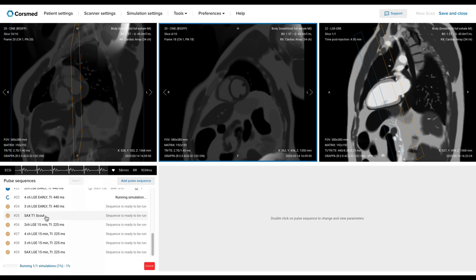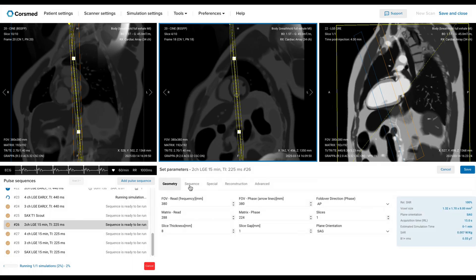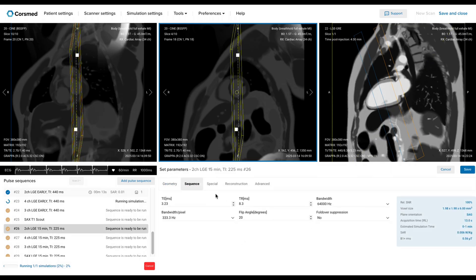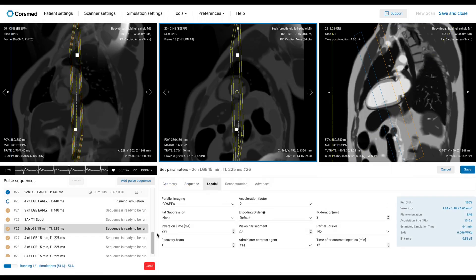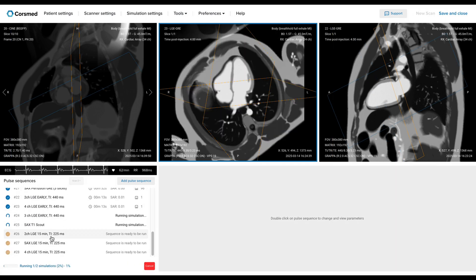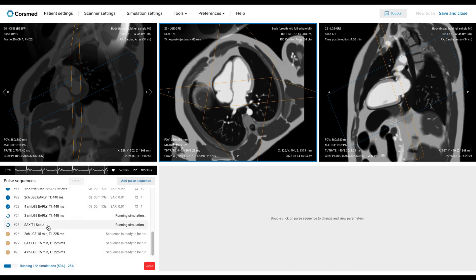While that's running, I'll get the late enhancement sequences going. For all these post-contrast sequences, we simply copy the positions from earlier sequences and then adjust the TI for each one. But first, let's run these early sequences. Before we set the inversion time for our late sequences, we want to check what value the TI scout recommends to null the healthy myocardium. This will make the healthy tissue appear black so we can see any scars clearly.